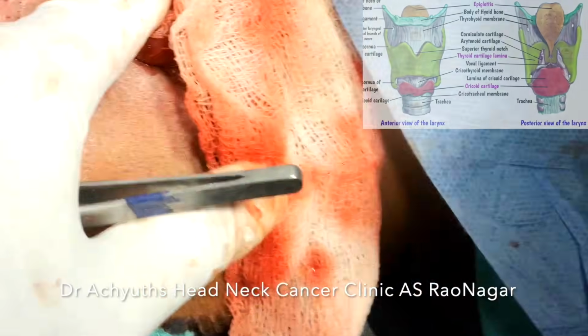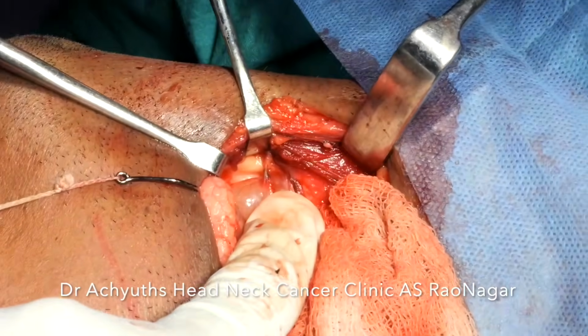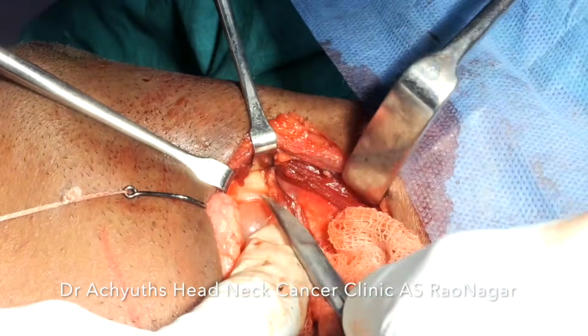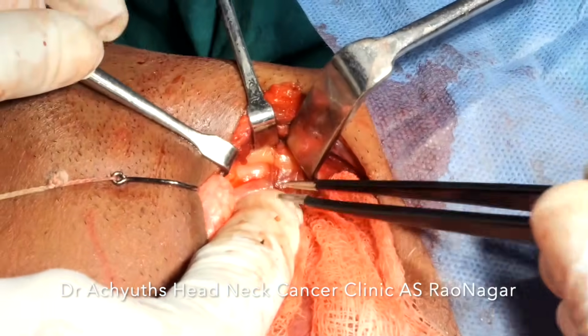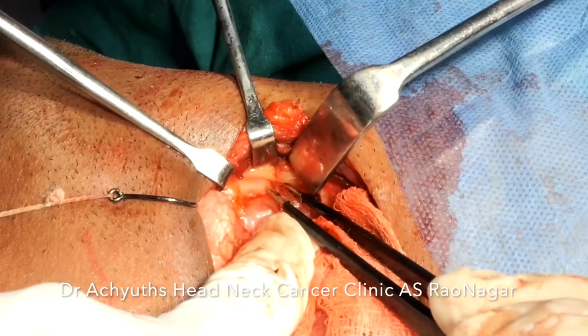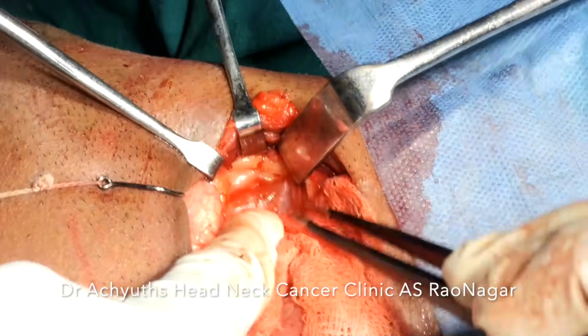technically it is not correct to call this endolarynx, but then we are in the larynx. Endolarynx usually is when we go through the oral route into the larynx. Here we are going from the cervical route only.